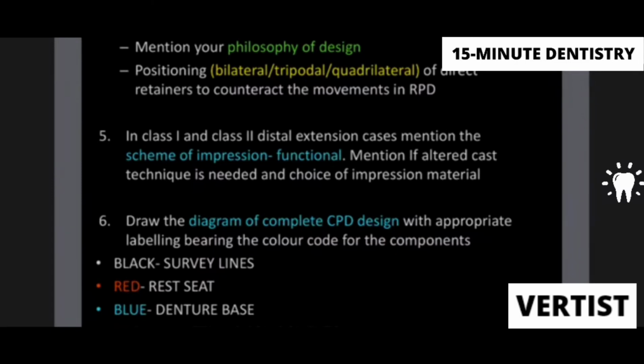If you have a functional impression that needs to be done, point number 5, mention that you have to do a functional impression and then draw your diagram with a completed CPD design. I'm going to show you how your diagrams look, a schematic representation, in your following slides.